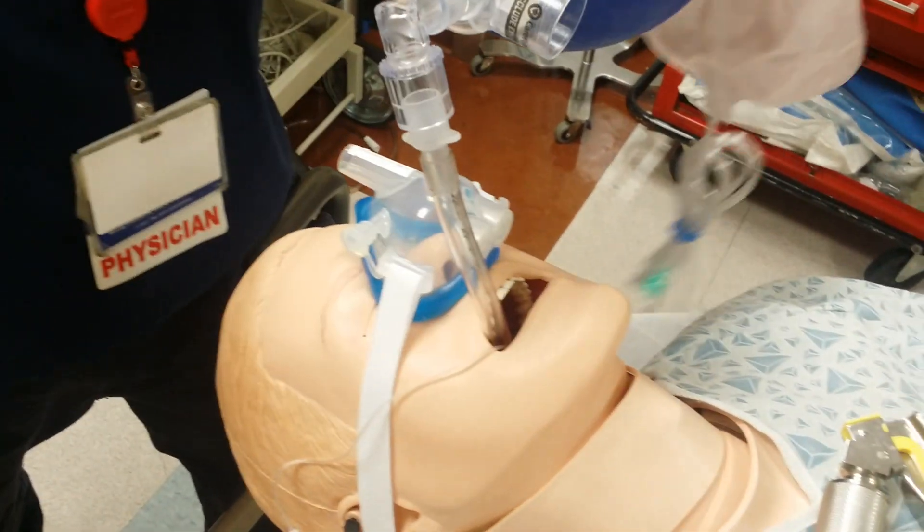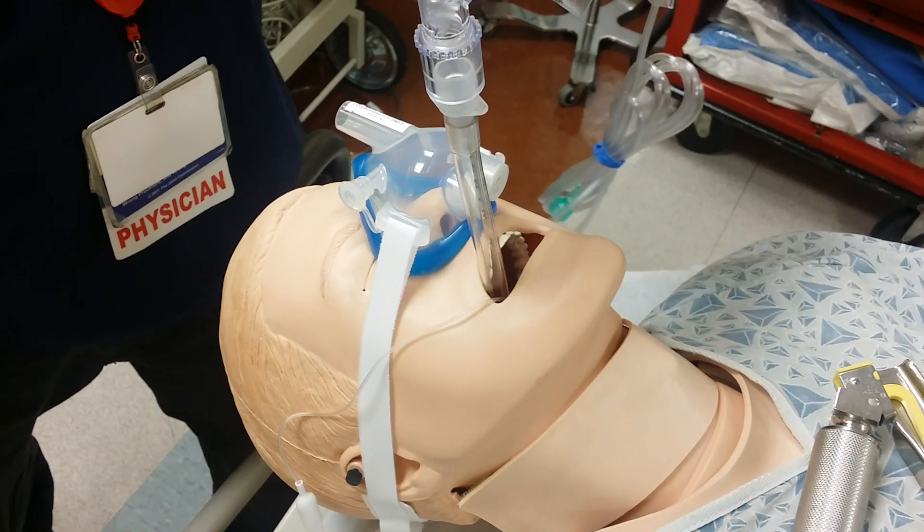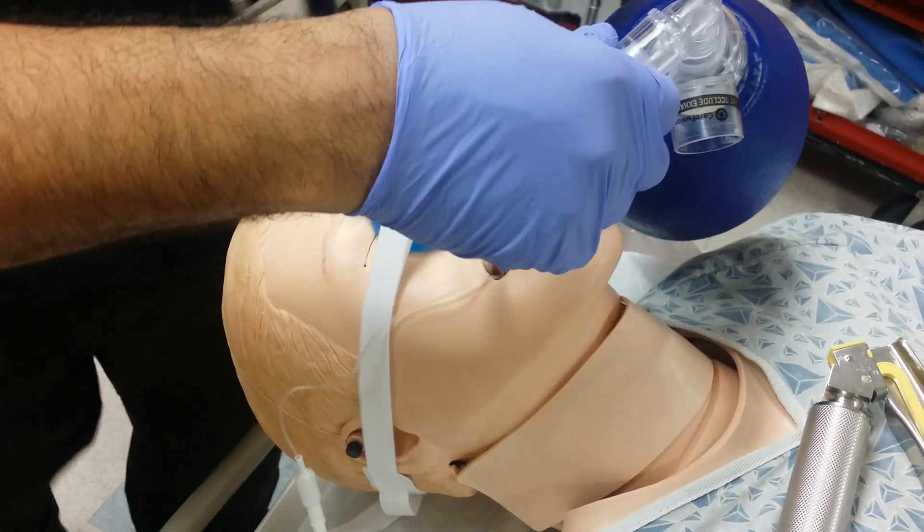I believe this device will change how airway management is practiced in the near future, if not now. Thank you — it's great.